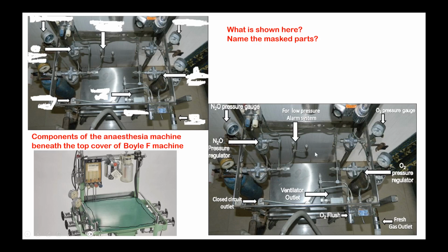So the mechanism or alarms that are present in this intermediate area tell you about the drop in oxygen supply pressure after the gas is released from the pressure regulator until it reaches the flow meter. In that level, if there is a drop, immediately you get an alarm that is called the oxygen supply or pressure fail alarm. Whereas the alarm situated at the flow meter level is the hypoxic guard or hypoxic alarm. Is it clear?